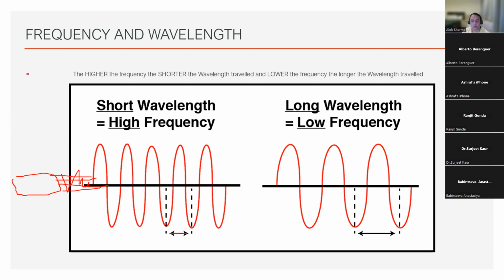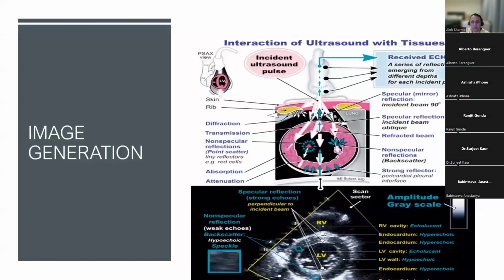I will use a low frequency probe because it can travel a greater distance. But the resolution that it will give me for the superficial tissues will actually be not as good. And it just means that I might then have to adjust certain things like focus or the frequency to try and better my image. And we will do a lot of that when we do our peer reviews.